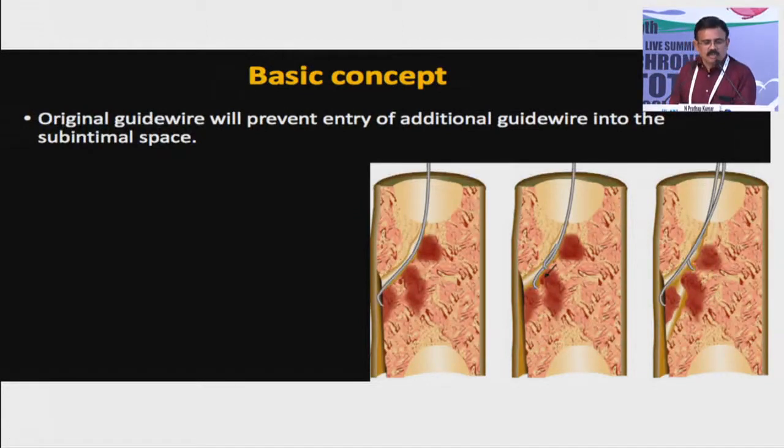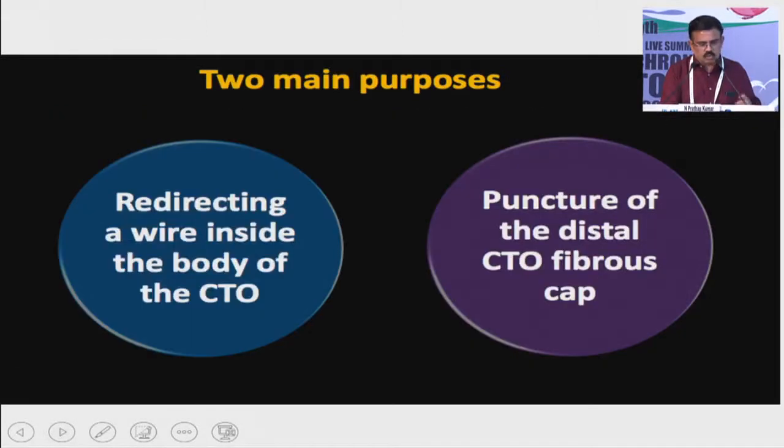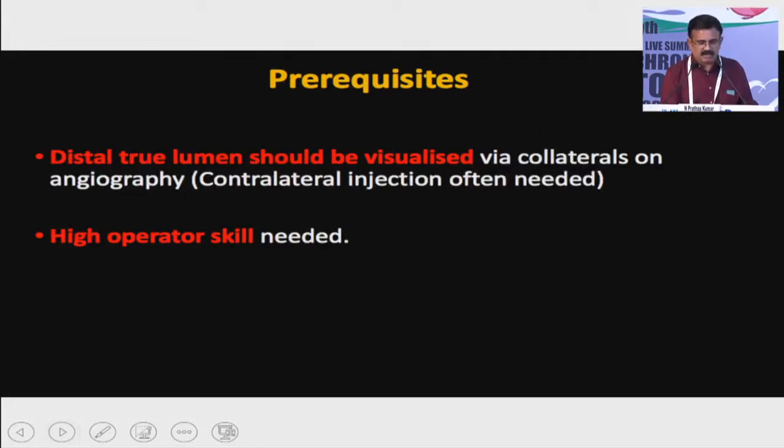Basic concept: the original guide wire will prevent the entry of an additional guide wire into the subintimal space. So you keep the wire in the subintimal space so that the next wire can go into the true lumen. What is actually the parallel wire technique? 2 main purposes: redirect a wire inside the body of the CTO and puncture the distal CTO fibrous cap. These are the 2 principles of that.